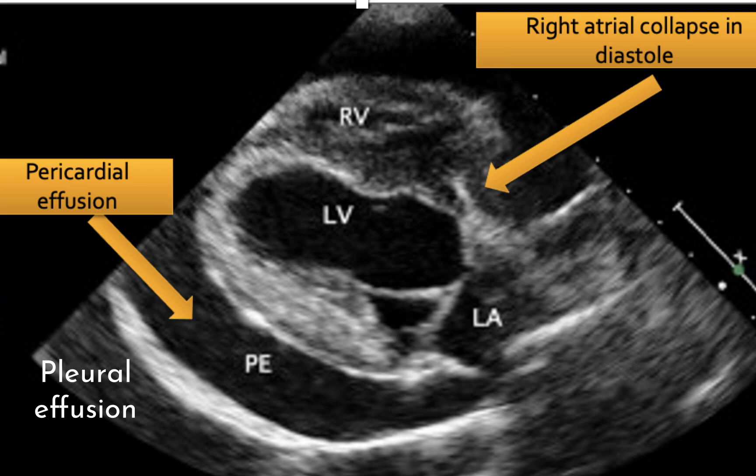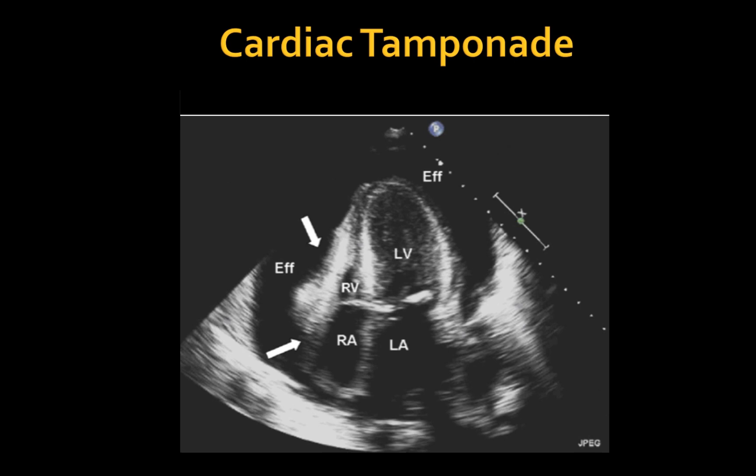There is also pleural effusion present. This is a left apical four-chamber view showing a moderate to large amount of pericardial effusion resulting in partial right atrial and right ventricular wall collapse.